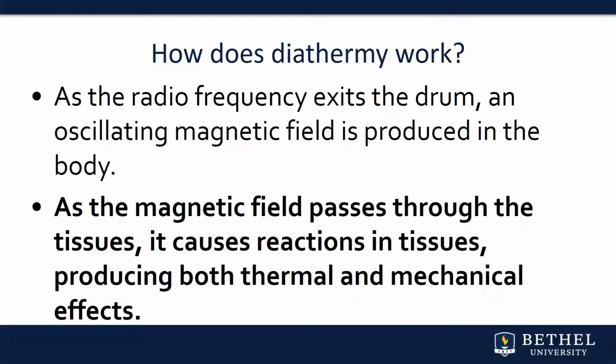As the radio frequency exits the drum, an oscillating field is produced in the body. So this drum sits down really close to the body, almost touching it. As the magnetic field passes through the tissue, it causes reactions in the tissue that produce thermal and mechanical effects, which are positive towards healing.